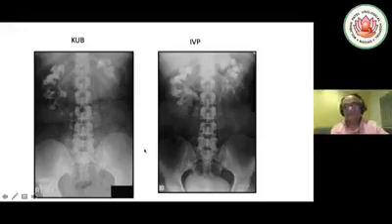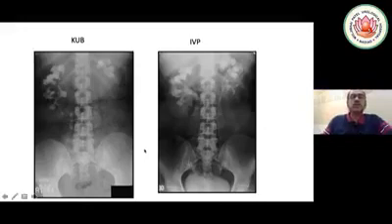Yeah, Dr. Gusti. Now look at this X-ray. Now the upper calyx shown on the left side, and upper calyx, middle calyx, lower calyx stone, and multiple stones in the ureter. Let us focus on the right side. Now you see the whole kidney, the whole calyx is actually above the 12th rib, and almost part of it going above the 11th rib.